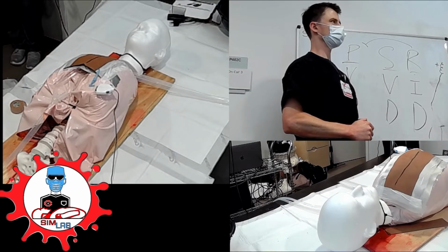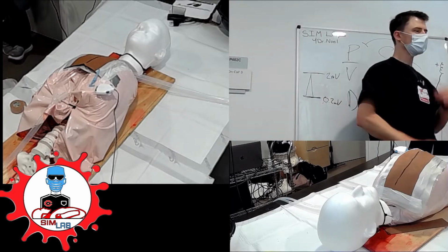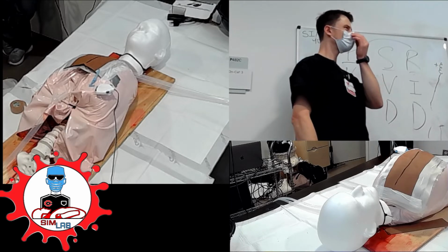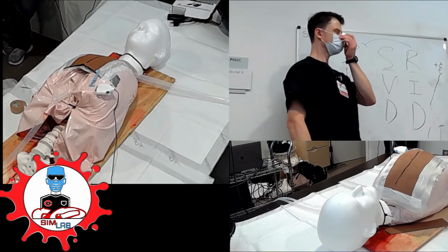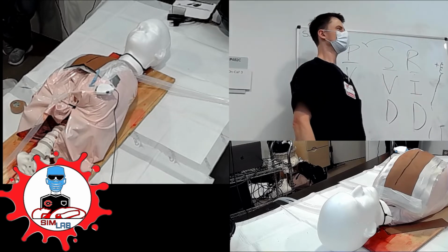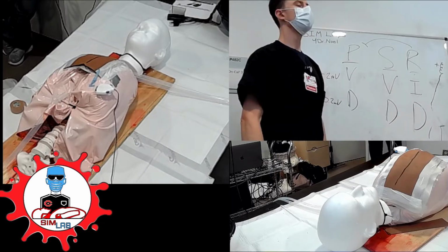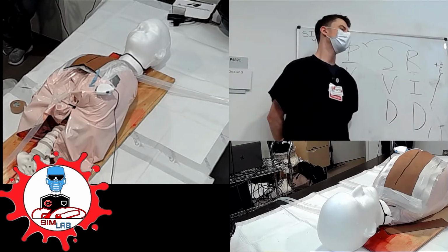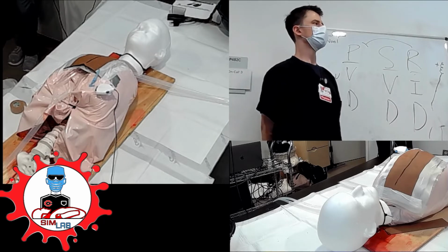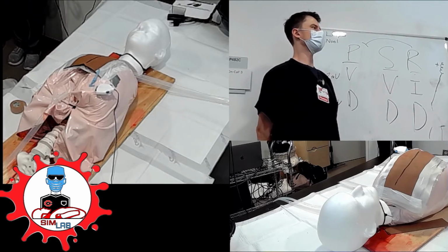Can I ask a maybe dumb question? Yeah. If they're AV pacing, you're just randomly picking which one to reground. I'm confused about why you can just pick either side to manipulate. Which one do you do? So I think it's rarer that our patients are AV paced. Oftentimes they're trying to maintain normal sinus rhythm.